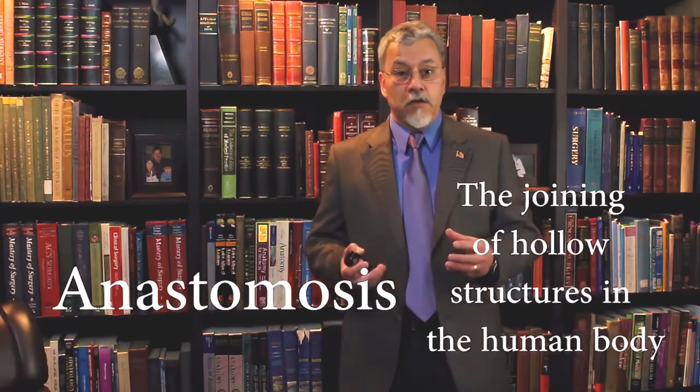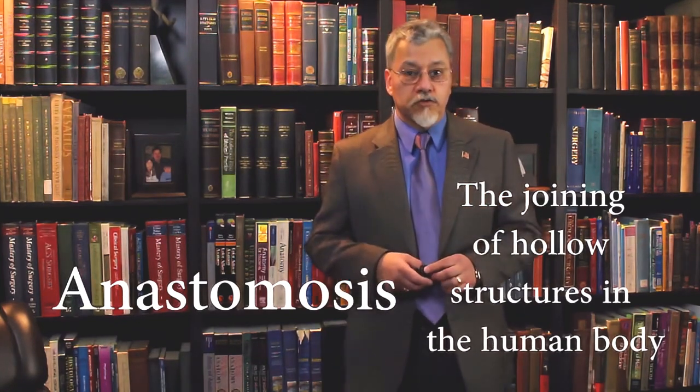Through history, there have been several materials used to perform an anastomosis, that is, the joining of hollow structures in the human body. Some of them, for centuries, have been sutures and staples and compression anastomosis. Today, we're going to focus mostly on the history of stapling.